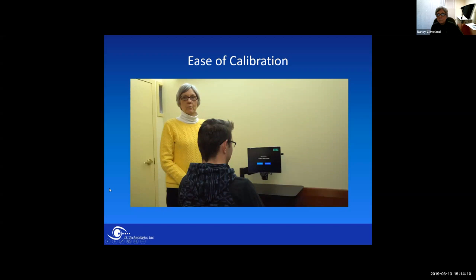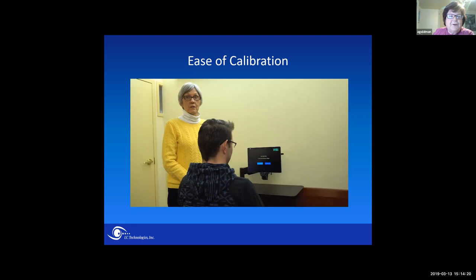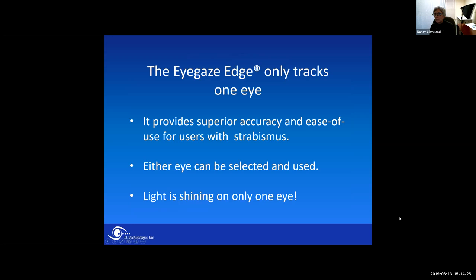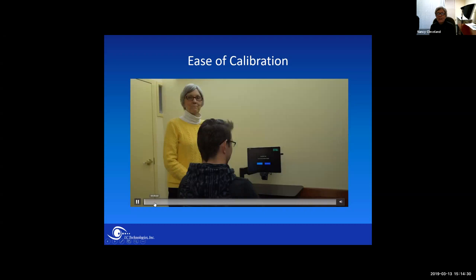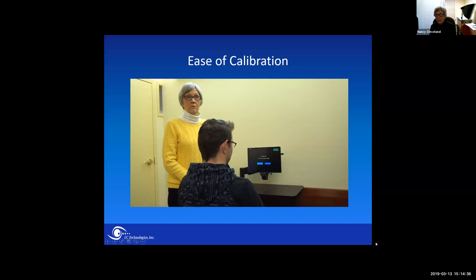A lot of people talk about ease of calibration with an eye gaze system. The iGaze Edge is by far the easiest system to calibrate, often taking no more than 15 seconds. It's all automated. So if you are doing an assessment and trying to calibrate someone, you don't have to do anything but let the system do the work.